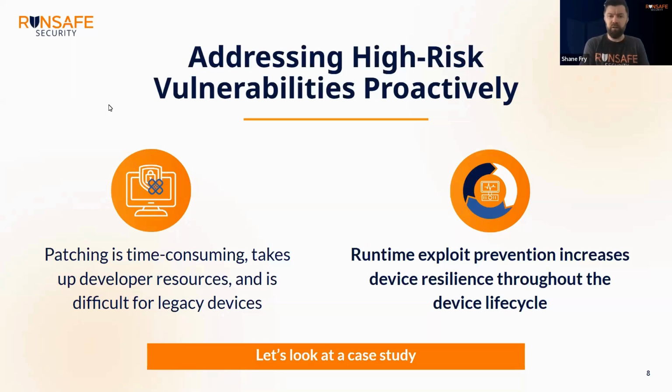And so that process is very time consuming. And it can be exceptionally difficult, as you talked about legacy devices earlier, right? How do you deal with a device that's outside of the scope of their support contract? So really thinking about that is important. And if you can deploy mitigations at the source code level or at build time, where you can mitigate vulnerabilities for the life of the device, whether or not it's supported, that's super critical.